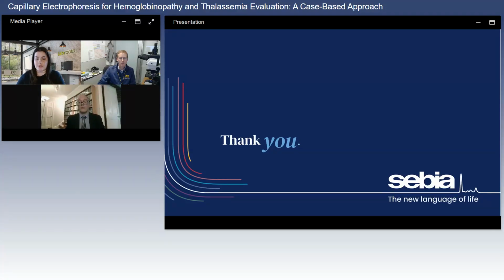Our first question says, you mentioned the hemoglobin position. Where can this be found if we are currently using a Sebia system? Okay, I believe that's a question for me. That's sort of a resources question. What sort of resources are available for knowing the position of particular variants? Sebia does have an online resource for looking up the position of some hemoglobin variants that we have seen commonly and we have been able to genotype.